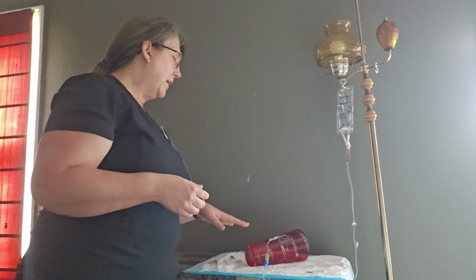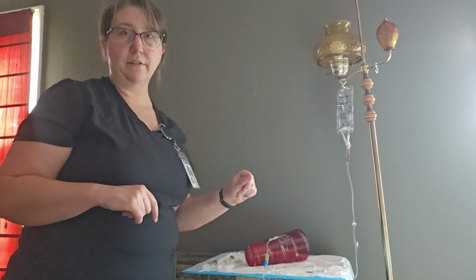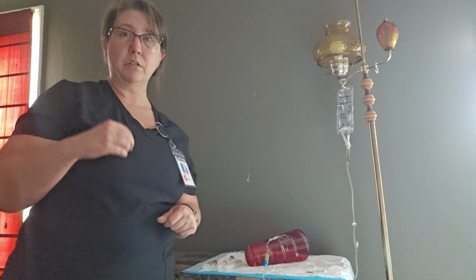As we go see our patient, we are going to perform hand hygiene and put on any kind of PPE that is required. Now we're going to go in and identify our patient using our 2 patient identifiers, and we're also going to check and see if they have an allergy bracelet on. We are also going to verbally ask the patient about their allergies.